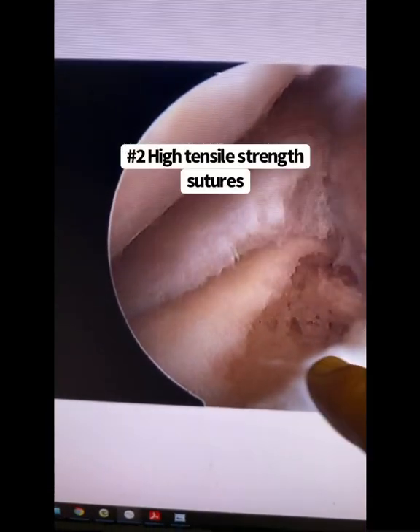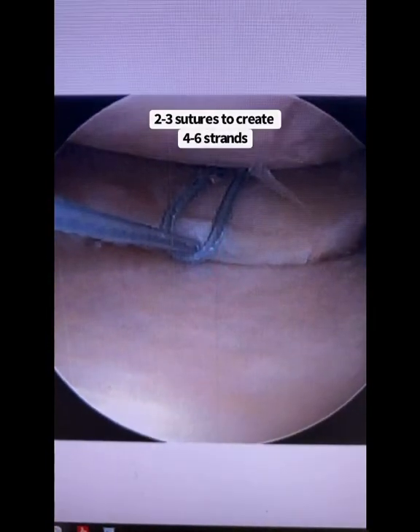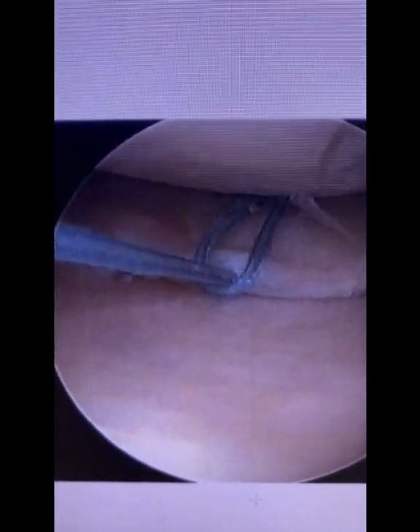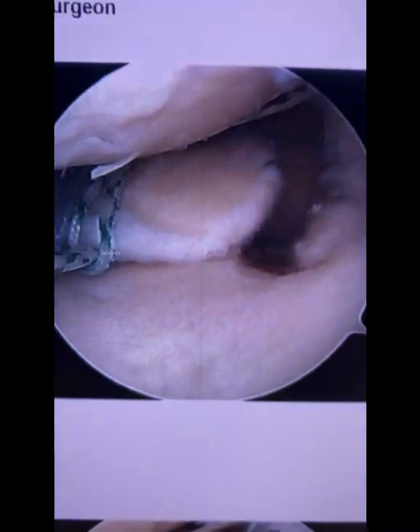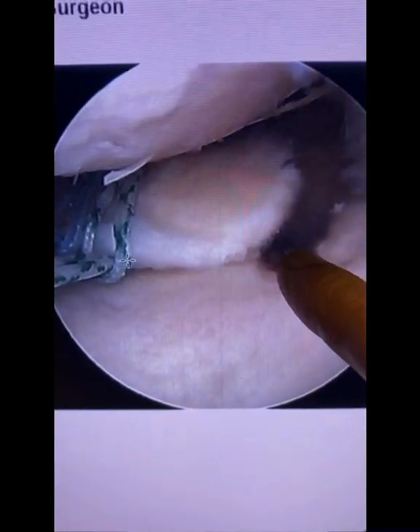Step two is attaching sutures to the meniscus. Step three will be making a drill hole right over here. Here are the sutures being put in. Many techniques favor smaller sutures that are not doubled up, but I have had great experience using doubled-up luggage tag number two high tensile strength sutures — I usually use two but sometimes three. There they are, placed into the posterior horn of the meniscus, and there is the bony trough.